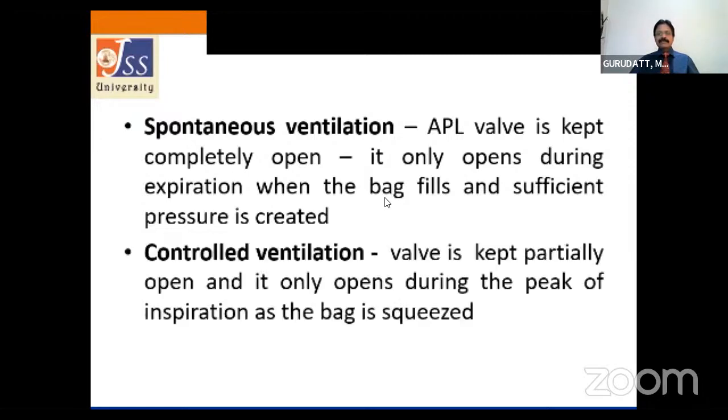So the next thing is, during controlled ventilation, the valve is kept partially open and it only opens during the peak of inspiration as the bag is squeezed. That means when the bag is squeezed, immediately it will not open, and when a sufficient amount of pressure is created, that too in the peak of inspiration, then only the valve will open.